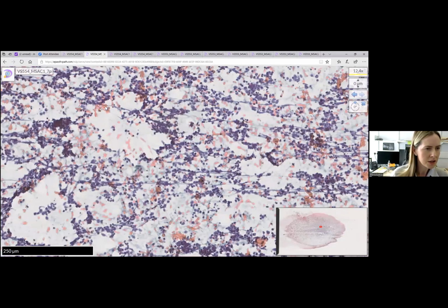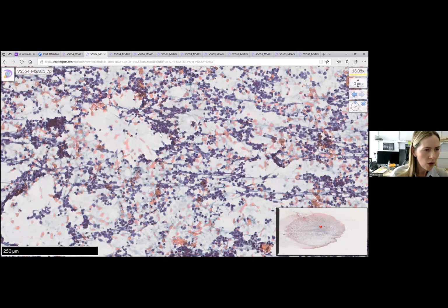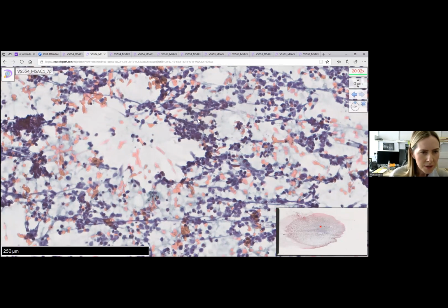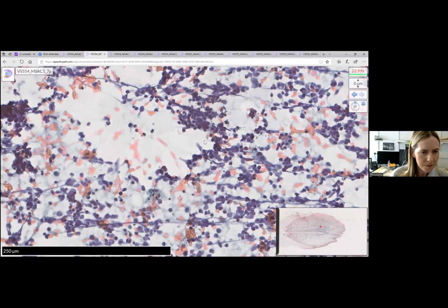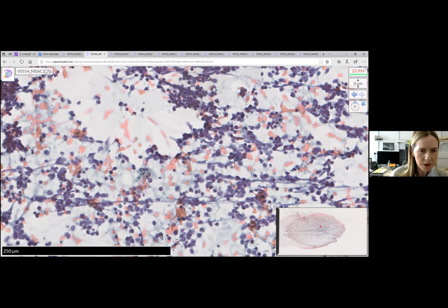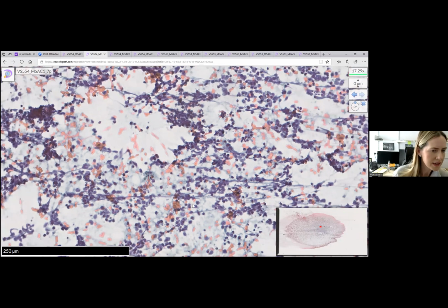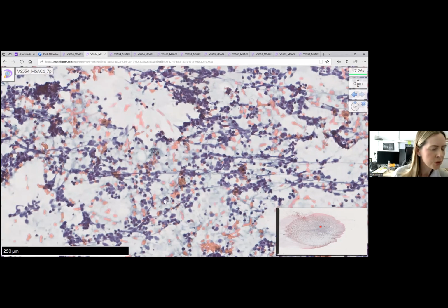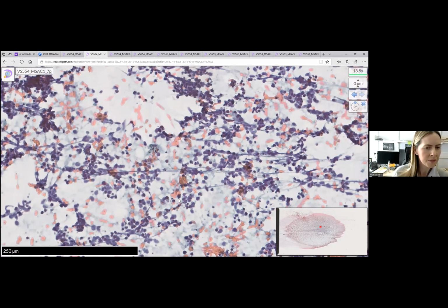You have this marked nuclear streaking. And then on the PAP, you can appreciate the nuclear molding, the scant cytoplasm, the stippled chromatin, and the inconspicuous nucleoli. So these all in combination are diagnostic of small cell. So in a case like this, you would call it a metastatic small cell or a high-grade carcinoma of small cell type, and you can perform cell block and confirmatory immunohistochemistry.